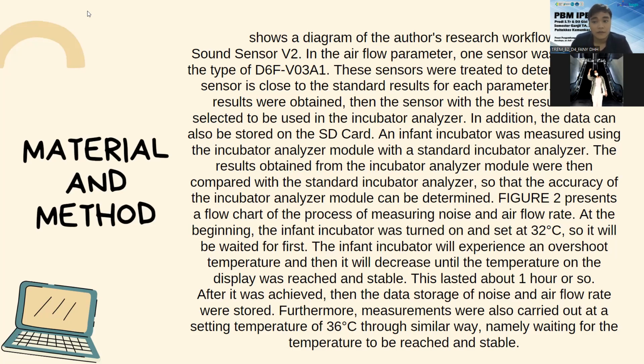An infant incubator was measured using the incubator analyzer module and a standard incubator analyzer. The results obtained from the incubator analyzer module were then compared with the standard incubator analyzer so that the accuracy of the incubator analyzer module can be determined. Figure 2 presents a flow chart of the process of measuring mean noise and airflow rate.